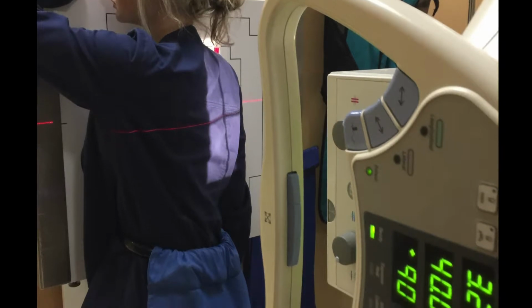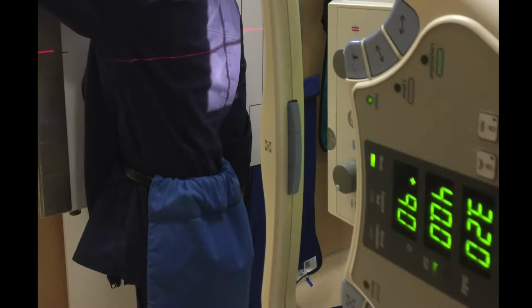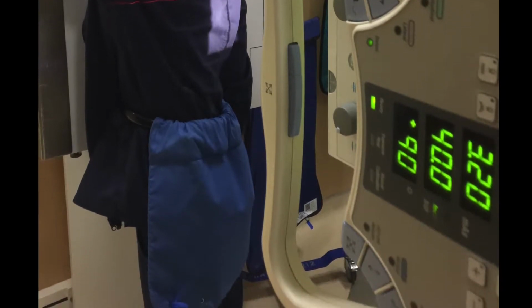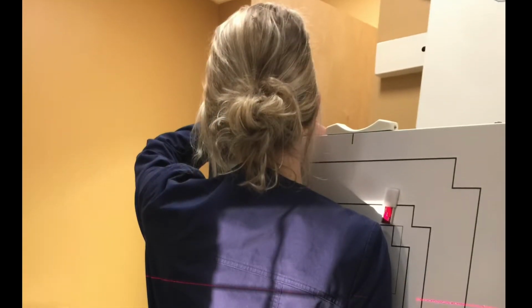Palpate the superior angle of the scapula and AC joint articulation. Rotate the patient until the imaginary line between those 2 points is perpendicular to the IR. Depending on the patient's body type, the amount of obliquity may range from 45 to 60 degrees.